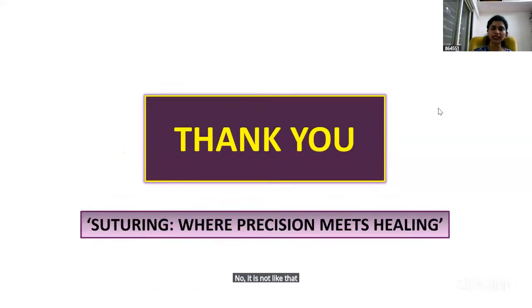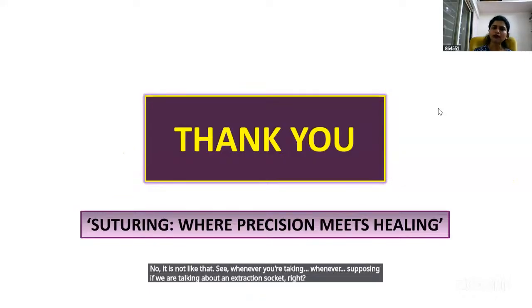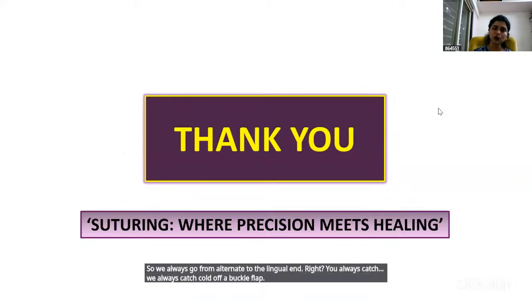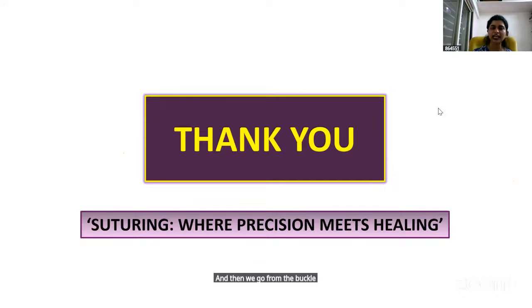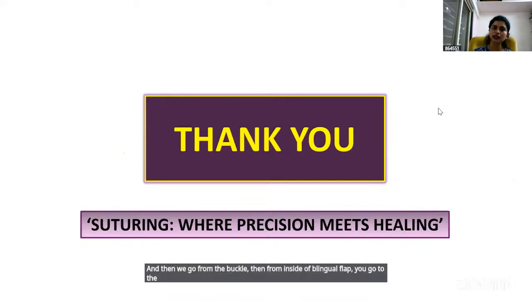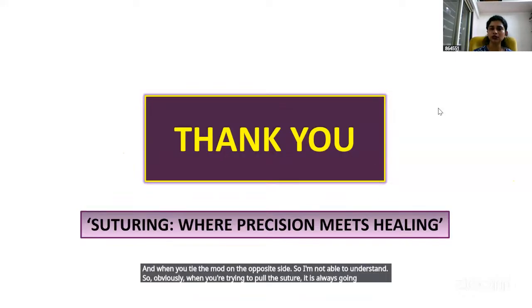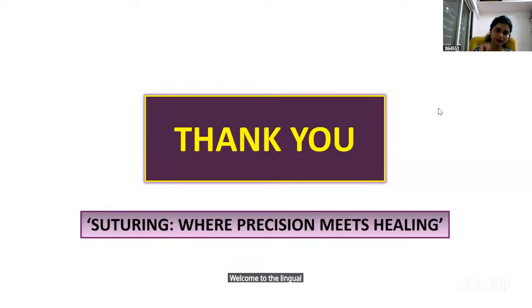Supposing we are talking about an extraction socket, correct? We always go from buccal to the lingual end. We catch hold of the buccal flap, go through it, then through the lingual flap to the lingual side, and then you tie the knot on the buccal side. So when you pull the suture, it is always going to be from the buccal to the lingual end, right? I hope I've answered it.